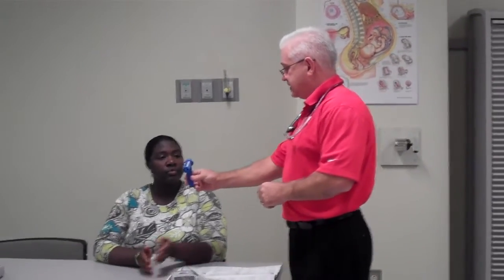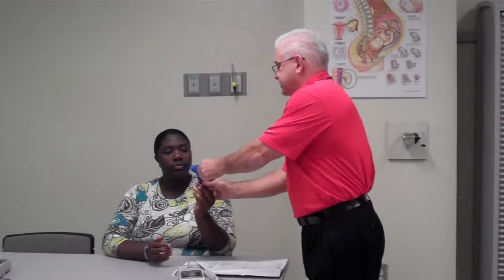After I listen to the breath sounds, I would instruct the patient as to how to do a peak flow meter reading. And a peak flow is going to measure the peak expiratory flow rate that the patient can do. Miss Stacy, what I need you to do is take this in your hand. I want you to hold it tightly. And then I want you to take a deep breath in, and when you do, take that mouthpiece, put it on top of your tongue, bite down, make a tight seal, and blow out as hard and fast as you possibly can.